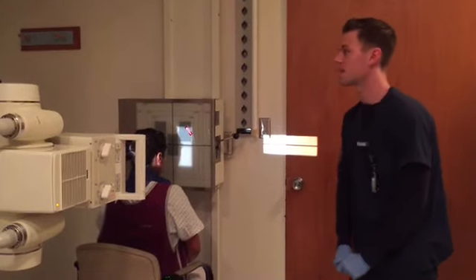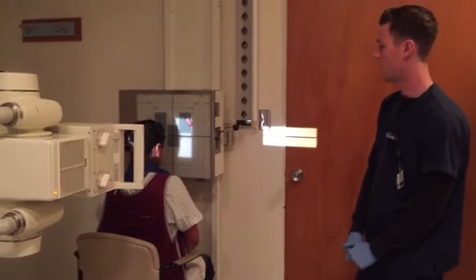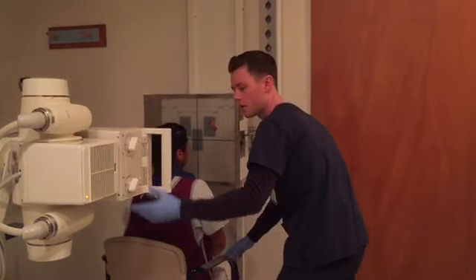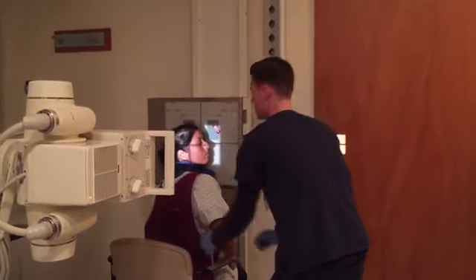Alright, I'm ready to shoot my next image now. We're going to do the lateral. So, we're going to have her turn a little bit into an LAO position. I'm going to have you scoot forward a little bit. Place the left side of your face up against the board. Just like that.